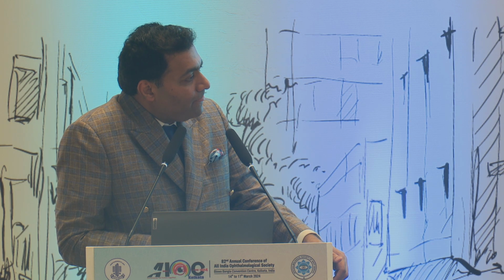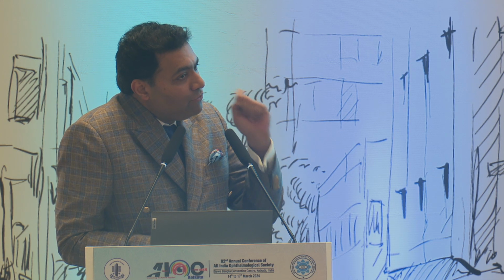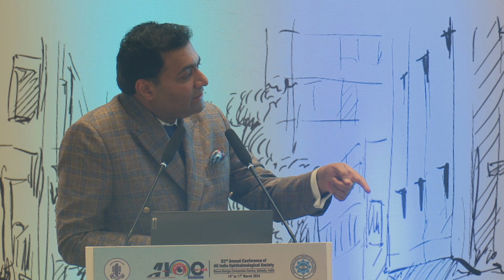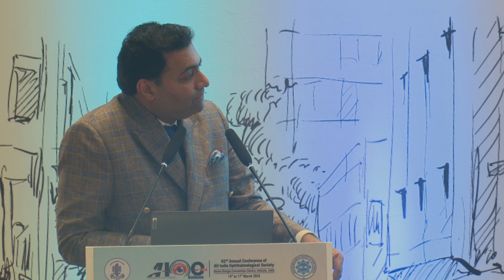But how long will the LipiFlow work for? Because of course it's just a one session treatment, right? So what's your duration of action? There'll be a window period in which you have to do your refractive procedure. If you do a LipiFlow and take the patient the next day, the eye is filled with inflammatory thing. So we wait for a week. A week. Okay, great. All right, thank you.